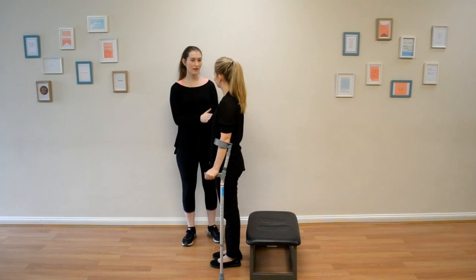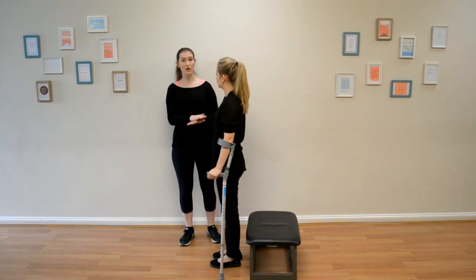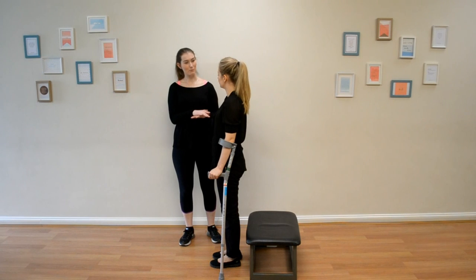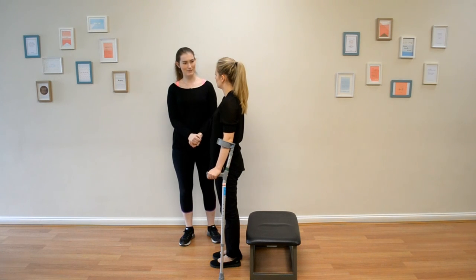When you're at home, depending on the height of your step, you'll find it's either easier to go up with your good leg, then your bad leg, then your crutches — or to go up first with your good leg and then the crutches and bad leg together. A nice trick to remember which leg goes first: good leg goes to heaven, so good leg goes up first; and bad leg goes down to hell, so it goes down first.